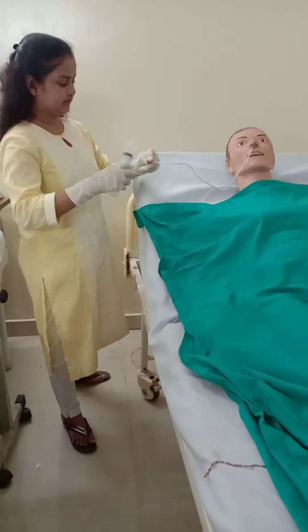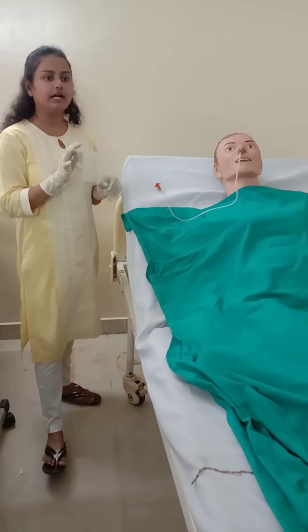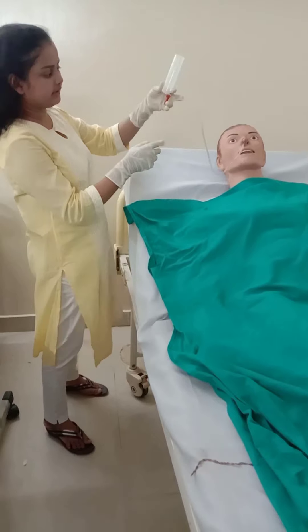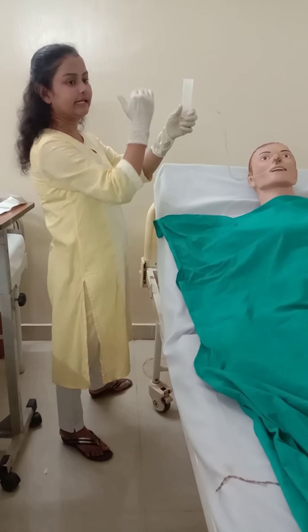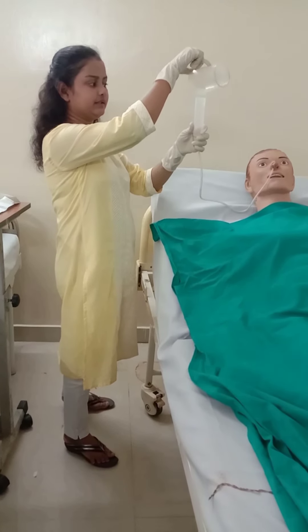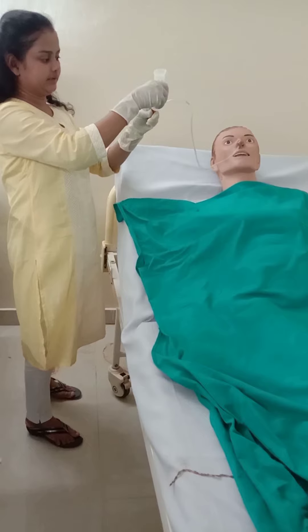After the gastric content check, clamp and close the tube, then discard the aspirated gastric content. Take the feeding cup and prepare the feed according to the doctor's advice — for example, RT feed 250 ml or 300 ml. Pour the feed into the feeding cup, attach the syringe to prevent air entry, and always keep the syringe at eye level. Unclamp and pour the feed at eye level. After feeding, flush the tube with some water to clear it.